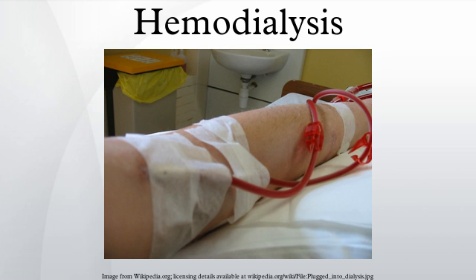Reuse of dialyzers. The dialyzer may either be discarded after each treatment or be reused. Reuse requires an extensive procedure of high-level disinfection. Reused dialyzers are not shared between patients. There was an initial controversy about whether reusing dialyzers worsens patient outcomes. The consensus today is that reuse of dialyzers, if done carefully and properly, produces similar outcomes to single use of dialyzers.